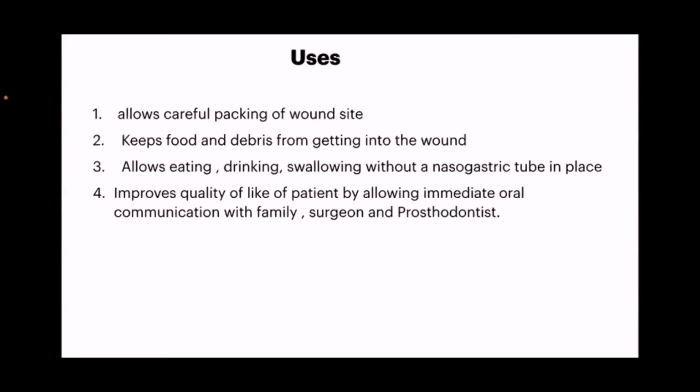Usefulness of surgical obturator is that it allows the careful packing of wound site. It keeps the food and debris from getting into the wound. It allows eating, drinking, swallowing without a nasogastric tube in place. It improves the quality of life of patient by allowing immediate oral communication with the family, surgeon, and prosthodontist.